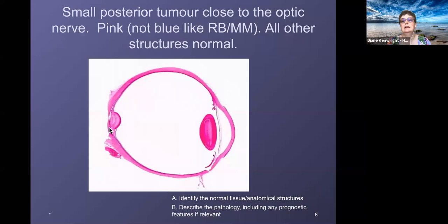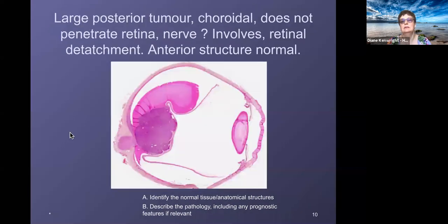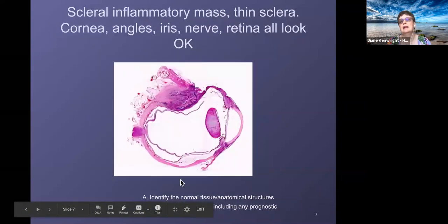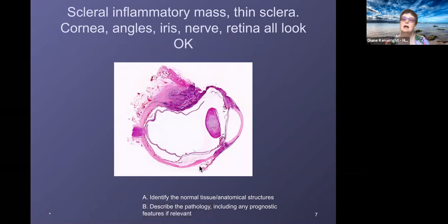It's here, it's here, it's here. It's a diffuse process that's happening throughout all the sclera rather than a well-defined infiltrating mass. Do you think that answers the question, Chris? Yeah, it sounds good.